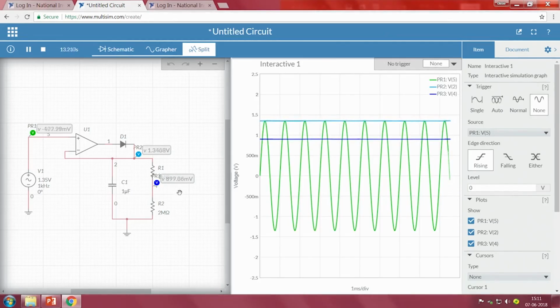Now, based upon our calculation, what is the threshold value? If we recall the potential divider circuit, it is nothing but V in into R2 by R1 plus R2. In this case, for example, V in is 1 volt, R2 is 2 mega, and R1 is 1 mega, so 2 by 3 is 66.6. So, that means if the input voltage is 1 volt, the threshold point is somewhere around 660 millivolts or 0.66 volts.